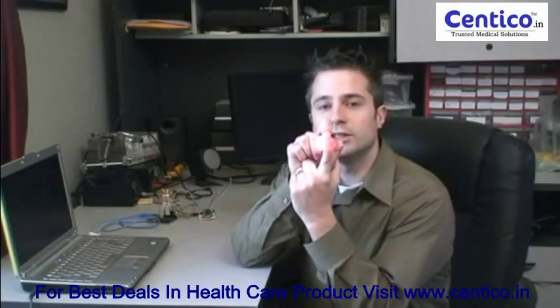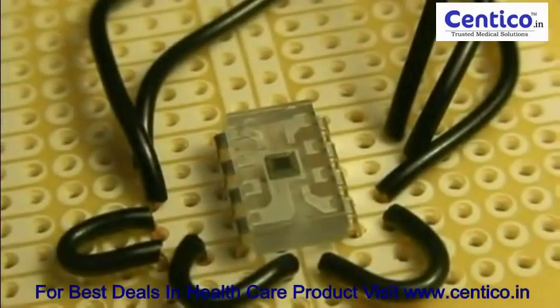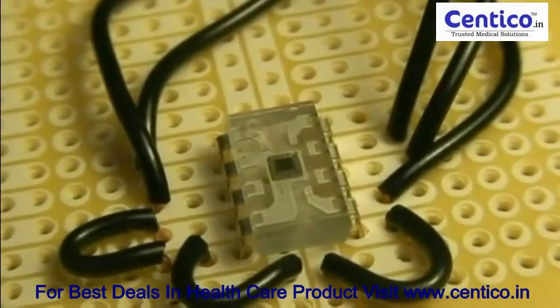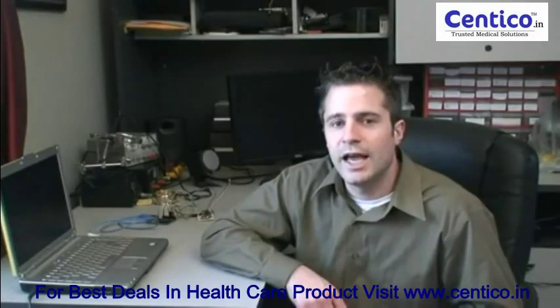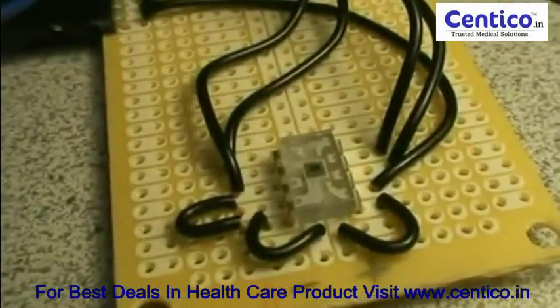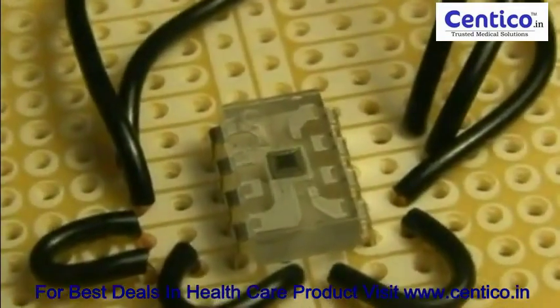It uses LEDs to shine light through your finger and then measures the light on the other side. This chip right here is a light sensor — it's got an array on the top and we can tell it how sensitive to be. It outputs a frequency based on how much light is hitting it, and then we can use our Arduino or microcontroller to measure the frequency and turn that into a value of how much light is hitting the sensor.